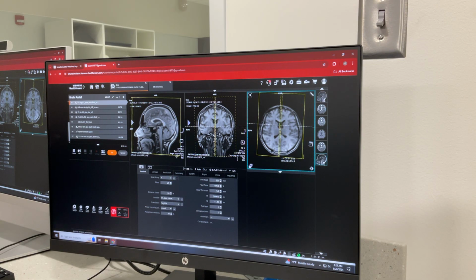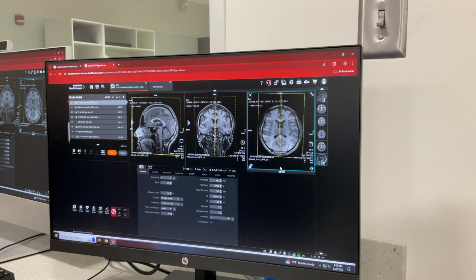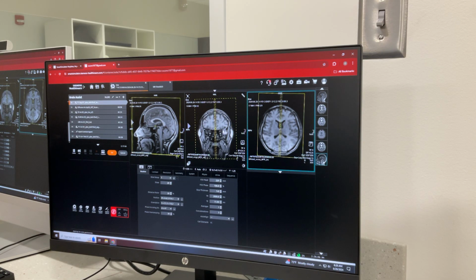There you go. A little bit more. Closer, right? My right. Your right. Left. My left. Yeah, your right. Good job. And you might need a slight angle on that coronal, that's being kind of nitpicky, but scroll through your couple images on that coronal. Oh, there it goes. Looks pretty good.